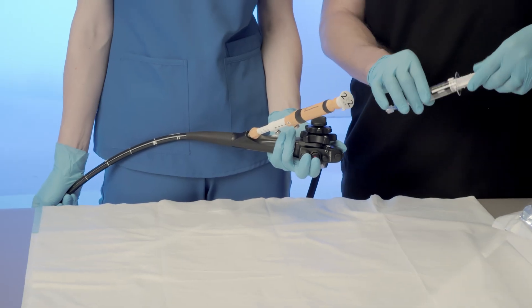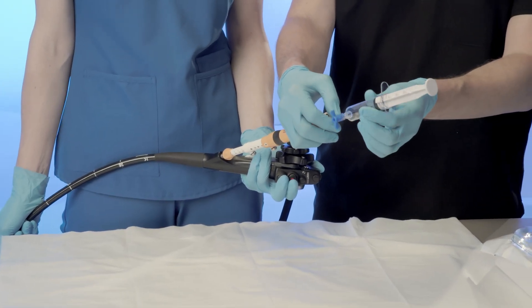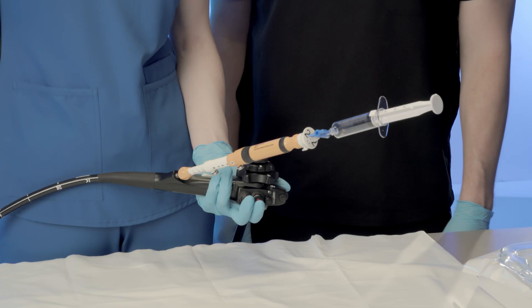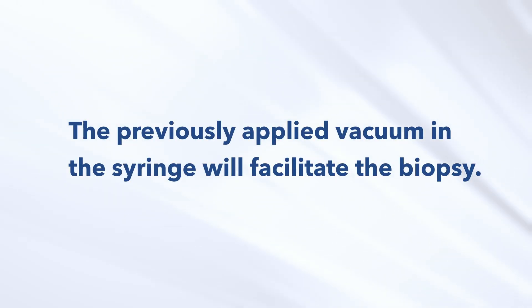Attach the luer lock fitting of the previously prepared syringe securely into the needle luer fitting at the handle end. Open the syringe by rotating the lever arm on the stopcock until it is parallel with the axis of the syringe. The previously applied vacuum in the syringe will facilitate the biopsy.